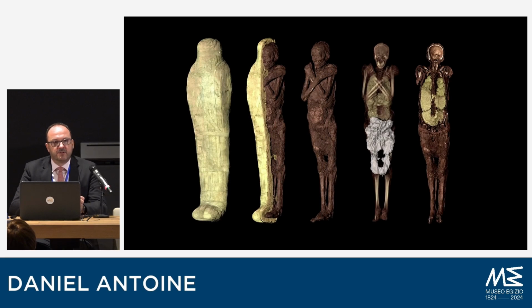And a lot of the work we're doing, we actually outsource. We work with a colleague, which I think our colleagues at the museum also use, Benjamin Moreno, who's fantastic at identifying the different layers so that we can ask a computer to virtually unwrap these individuals. And we're doing it manually, not automated, so that we can be as close to the truth as science allows us to get, so that when we do remove the bandages, there isn't any bandage left, and we are really revealing the skin of the individual, because of course we're applying fake colors, which are very useful to hide any errors.